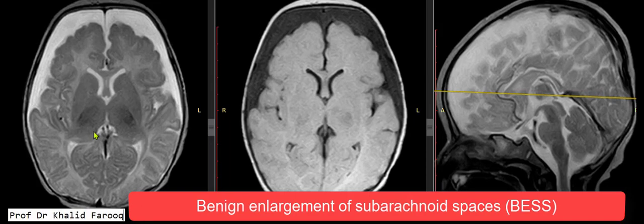Bismillah ar-Rahman ar-Raheem. Assalamu alaikum wa rahmatullah. Here we have an MRI brain of a three-month-old baby who presented with fever and fits. We can see the head size is relatively increased and there are prominent subarachnoid spaces around the frontal lobes anteriorly on both sides.